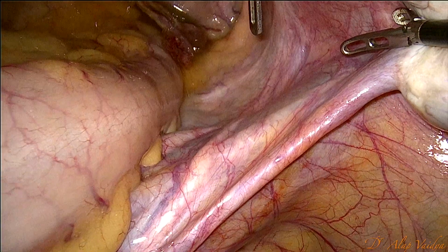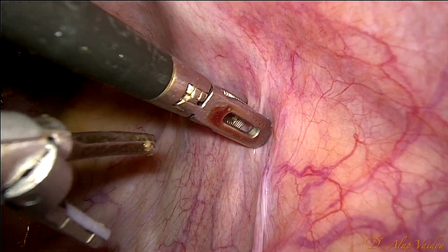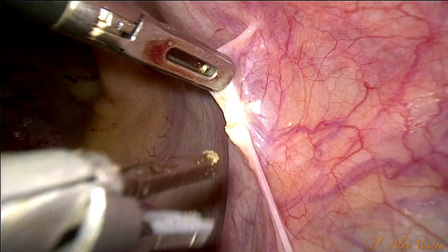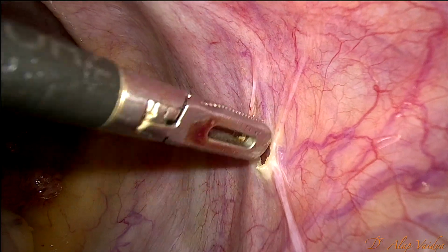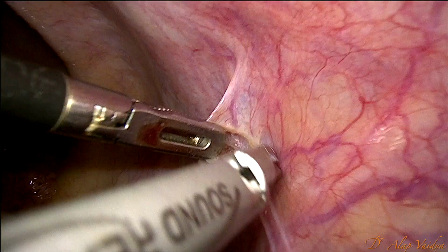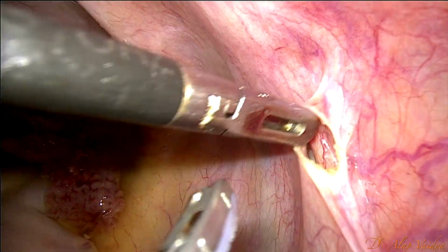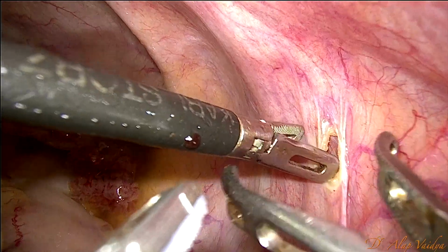Once you start doing those two approaches, this is just a variant of the medial approach where you pick up the peritoneum just above the ureter, put a small nick and make a window. First you have to visualize the ureter, that is it, and the uterine will be just next to it.